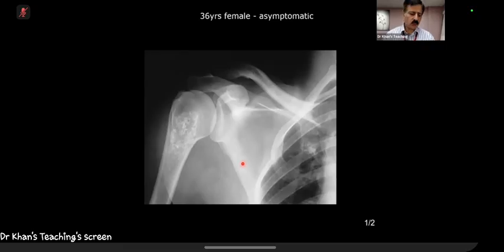They will show you enchondroma in the exam with signs of malignant transformation. Classical viva questions will be where the examiner is going to lead you: is there malignant transformation or not? The theory behind it is that enchondroma in the long bone, you might not see any lucency.